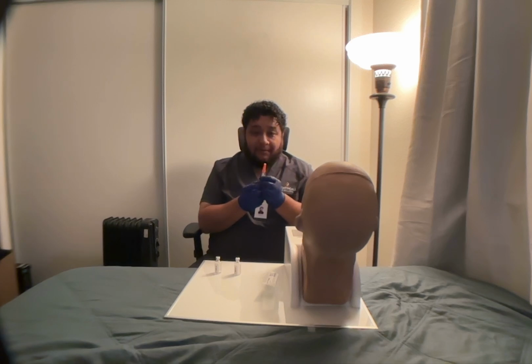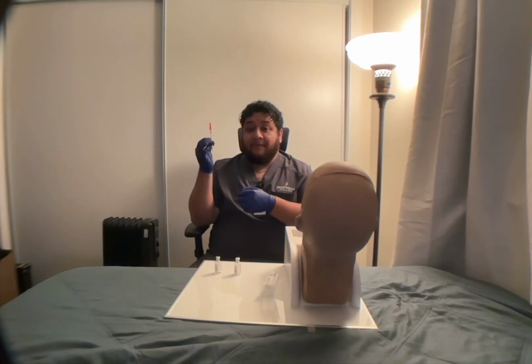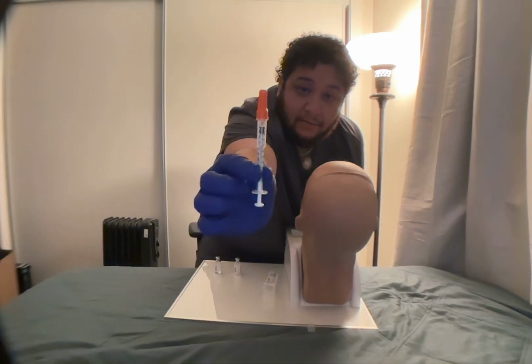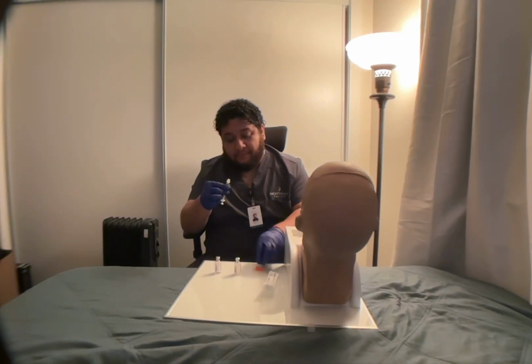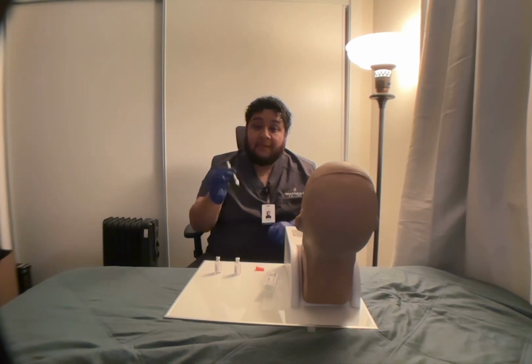To start off, I'm going to draw 8 units of air. I'm going to verify with the nurse and with the MAR, and I will show the camera, like so. Once that's done, I'm going to take the cap off, place it gently, and inject the syringe into the NPH vial.